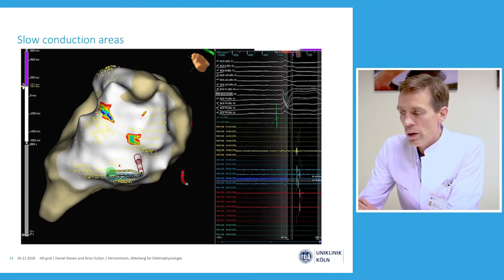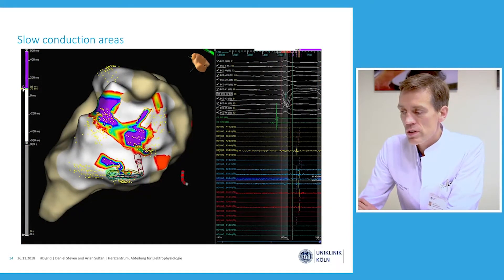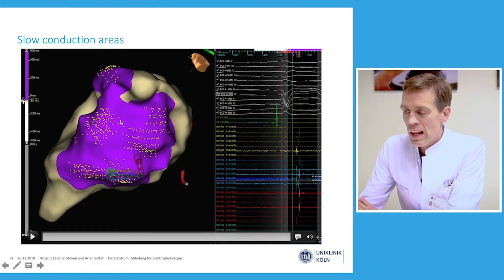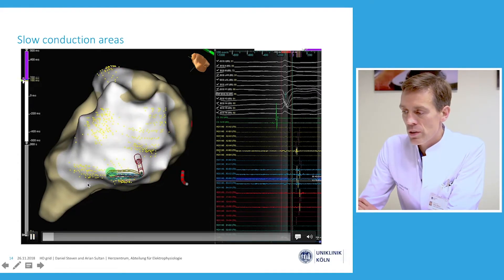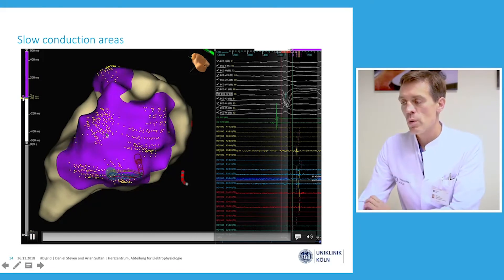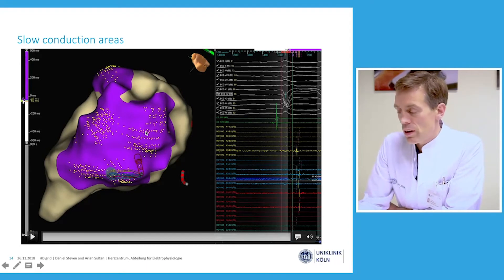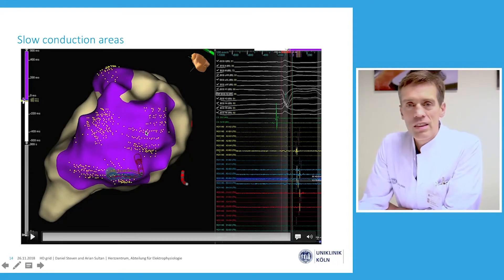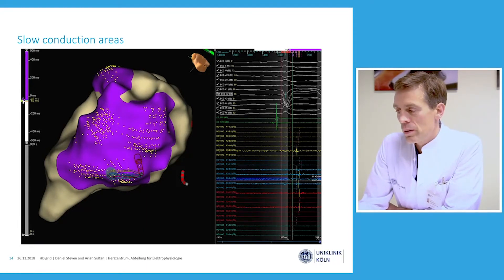In identifying those slow conduction areas, we are clearly able to see the LAVAs — the late abnormal ventricular electrograms — displayed here. The latest activation is displayed in these areas where the spread of the ventricular tachycardia and the exit to the ventricular myocardium may occur.